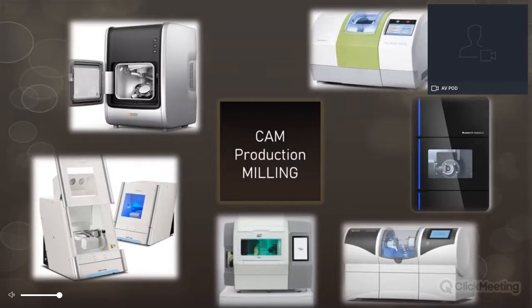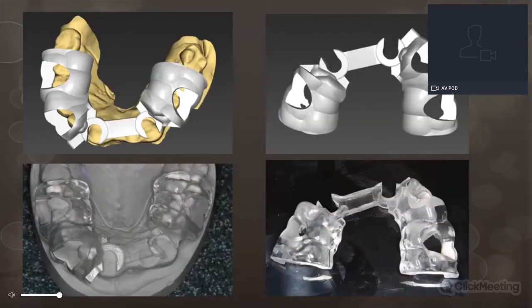Finally, the production phase, which is the milling phase. Again, we can see how fast technology evolves. 2-3 years ago, we were really milling surgical guides. Printing was in its infancy as far as the in-surgery options go. Of course, they could still be outsourced to a central facility, but for chairside, if you had the option of a 5-axis or even a 4-axis mill, you'd be able to mill a guide. Here we can see a milled guide that's been prepared, ready for placement of implants and planned in the software.